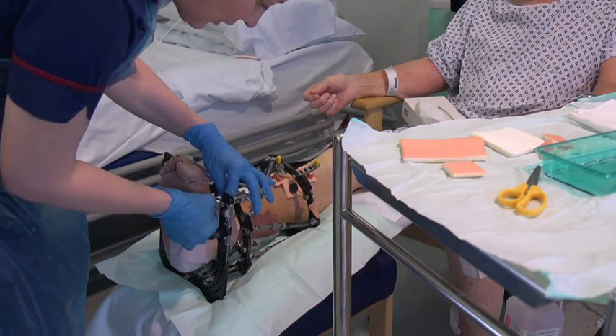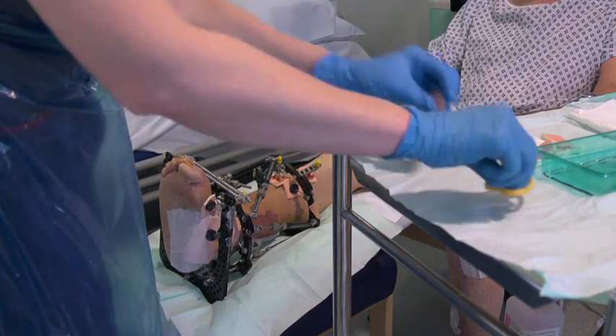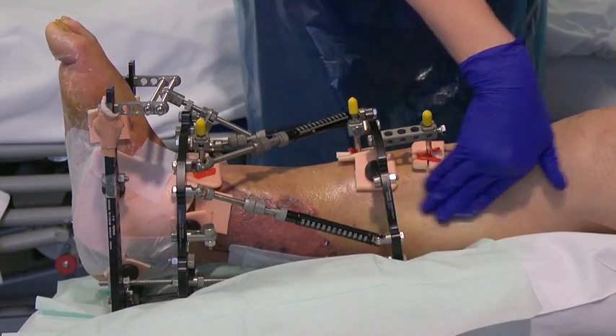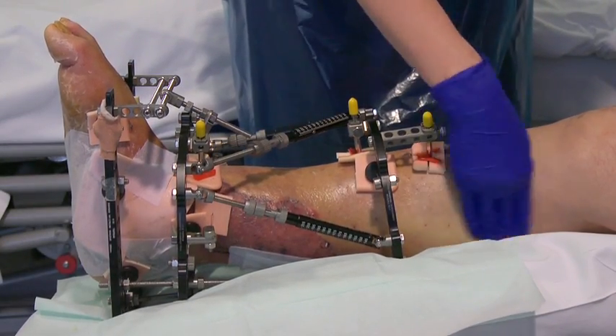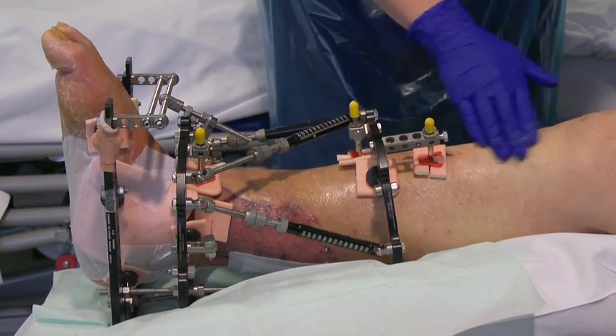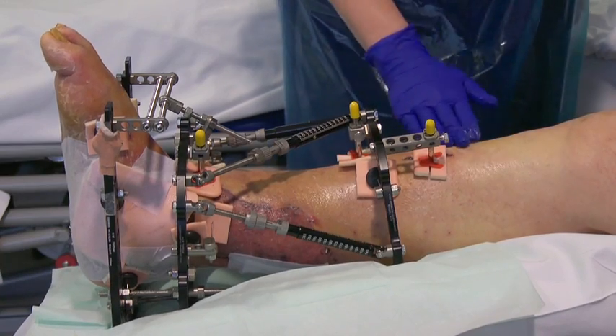The dressings are designed to soak up any ooze coming out of the pin, as well as preventing dirt from getting in. You may find your skin gets dry or itchy when the frame is on, so use a moisturising cream on your skin, keeping any creams away from the actual pin sight hole.